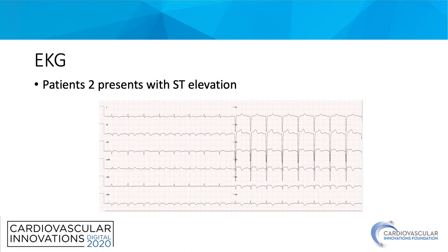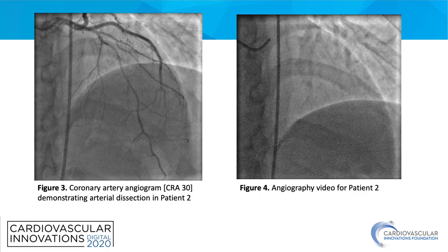This could be a potential sign to look out for with SCAD in female patients. For patient 2, we see figures 3 and 4 — the coronary artery angiogram and the angiography video. Patient 2's angiogram is a little more subtle, and we do see indications of an intimal flap after the large septal branch. We consider this to be a case of type 3 tubular type SCAD.